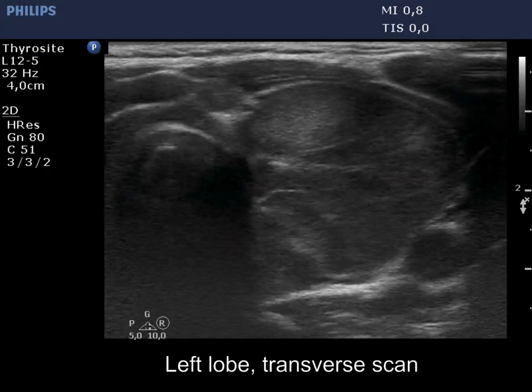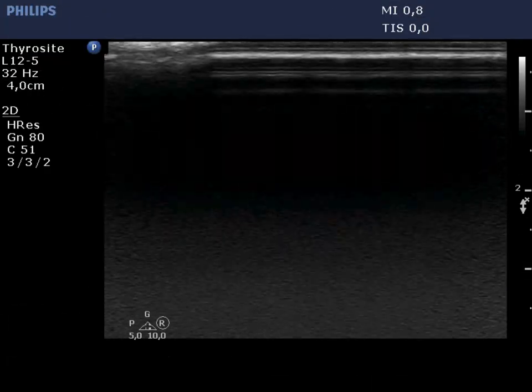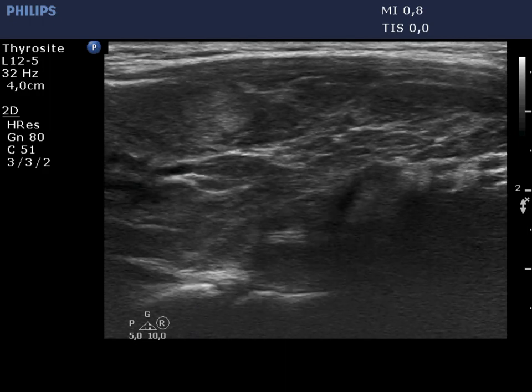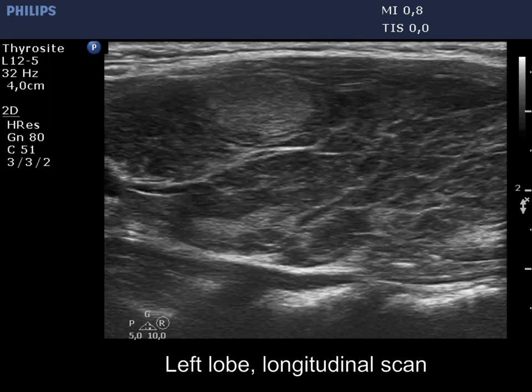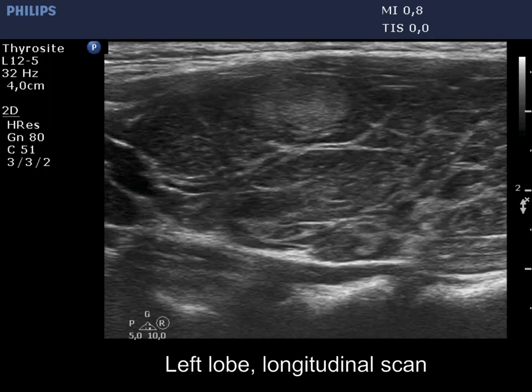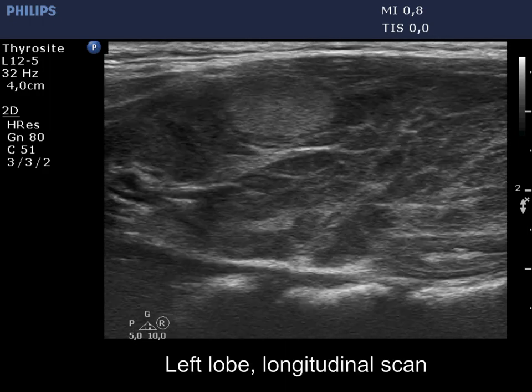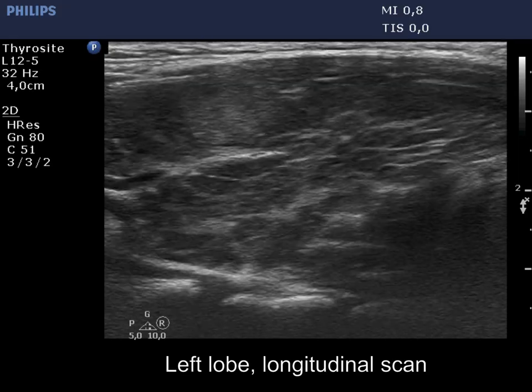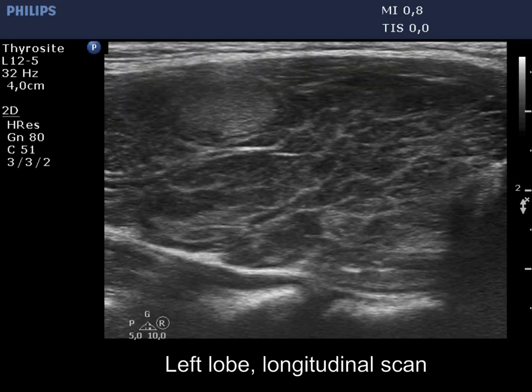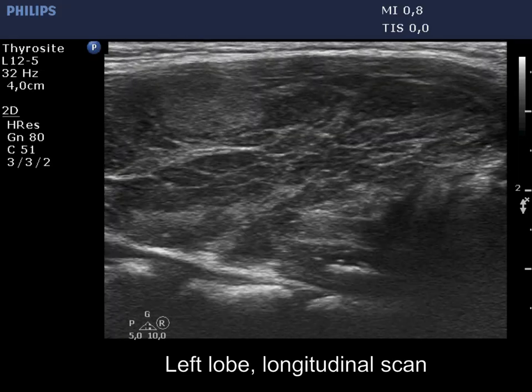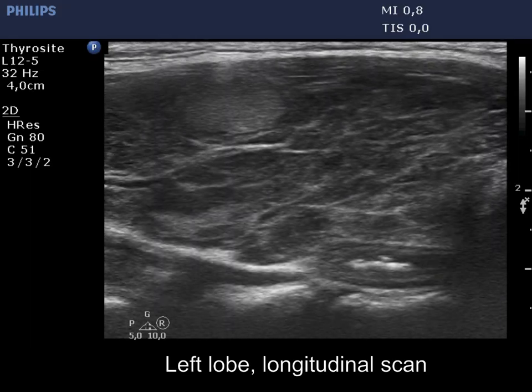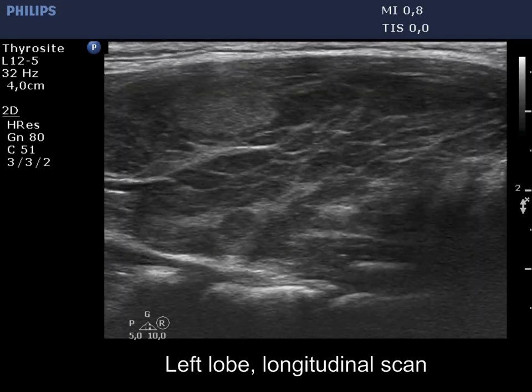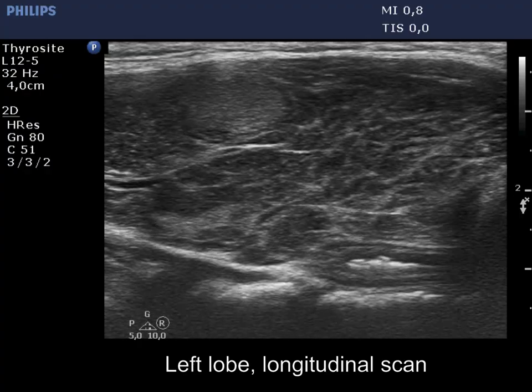There is a lesion in the ventromedial part of the left lobe. It is doubtful whether this is a true nodule or the largest intact part of the thyroid. The ill-defined borders favor the latter.